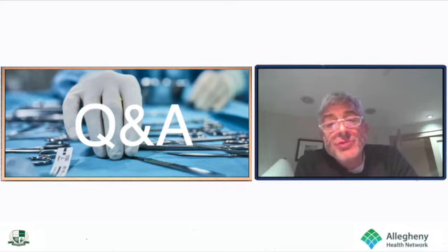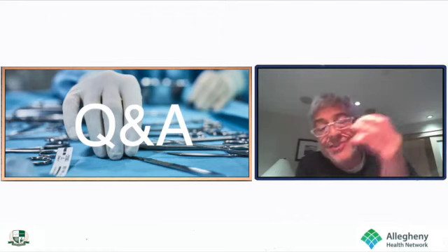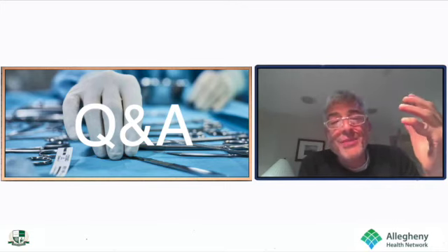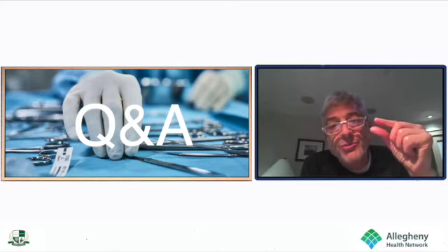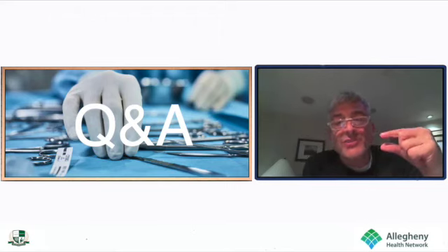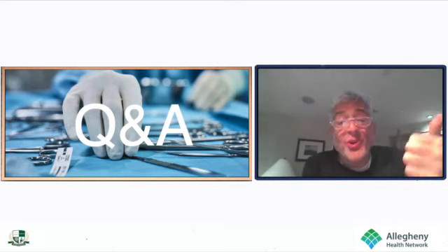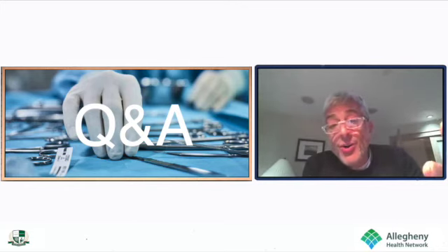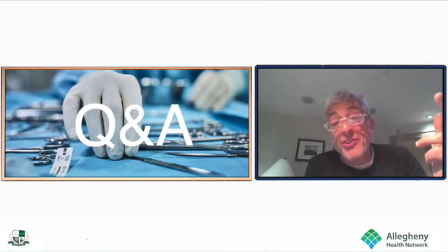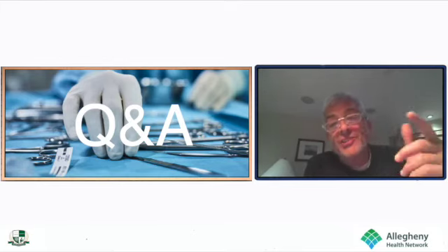Now, dropping down to the translaminar facet screw fixation, the best analogy is looking at doing an anterior cervical discectomy and fusion. Do we really need a robot for that? It's such a small incision. You can get in there, you can get out. It's a very predictable, refined operation. Yeah, someday we're going to be doing it a little bit better, but the incremental improvement with technology for an ACDF is small. Likewise, that incremental improvement for translaminar facet screw fixation was probably pretty small, at least in my mind it was. By the time I set up the robot, by the time I did the registration, by the time I did the perc holes and put the screws in, I could have done four other translaminar facet screw fixations. So the technology was great. It'll work for it, but it wasn't the right technology for that application.